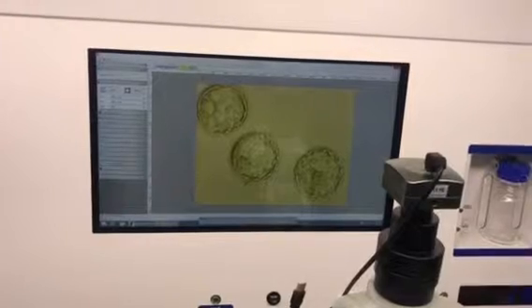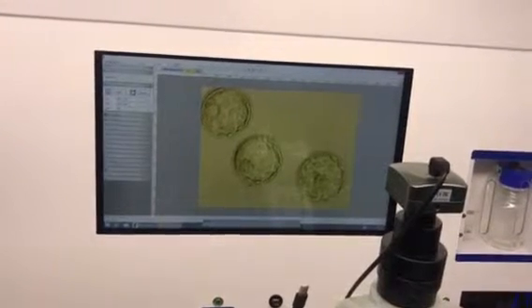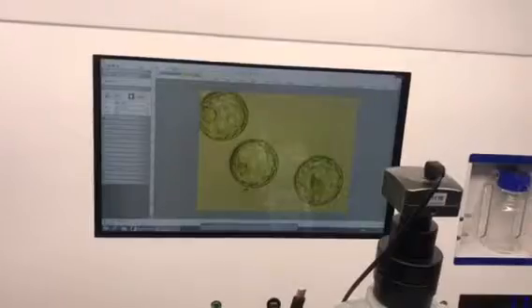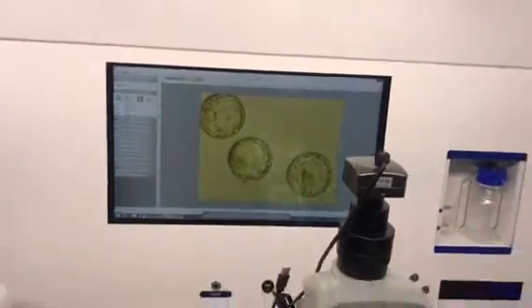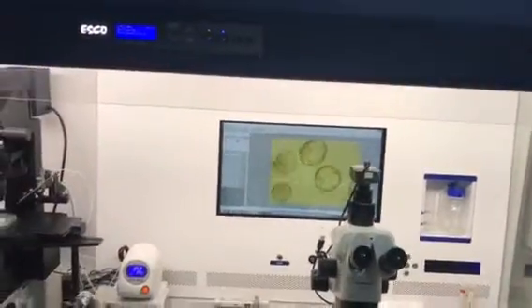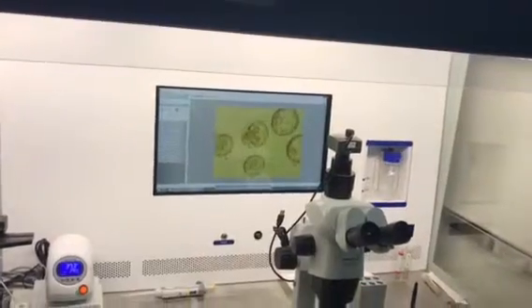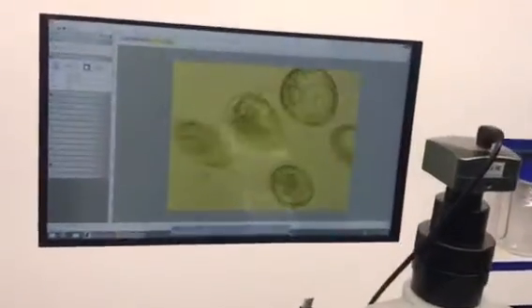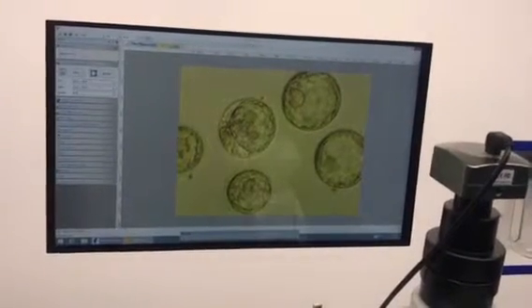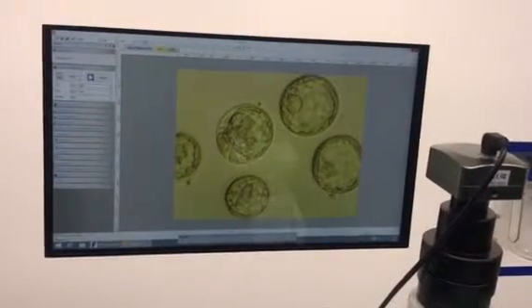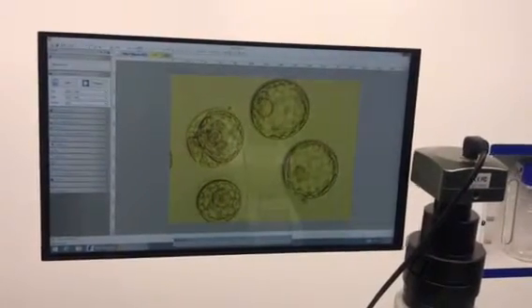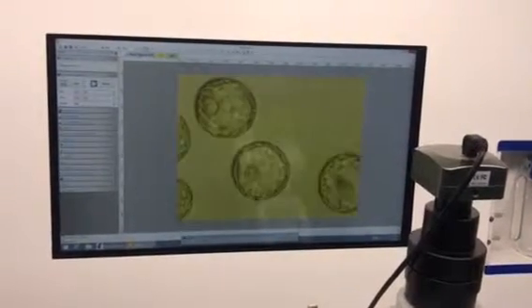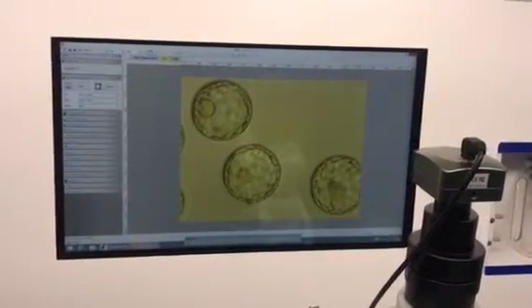We are going to transfer only two embryos, since this is a previously failed implantation case. We have six blastocysts. This is graded 3AA, and this one is a slightly collapsed blastocyst.